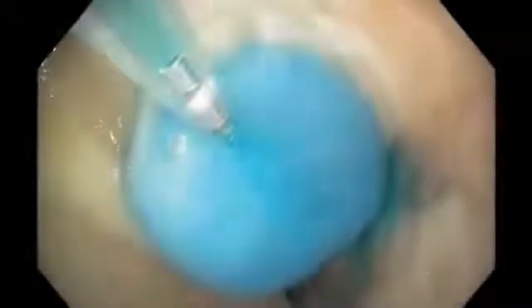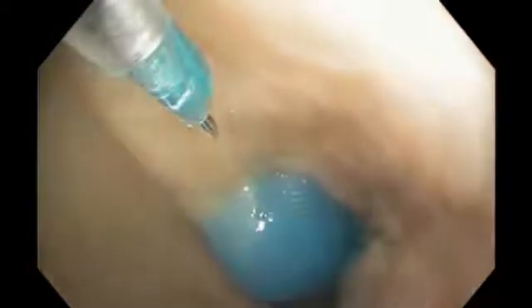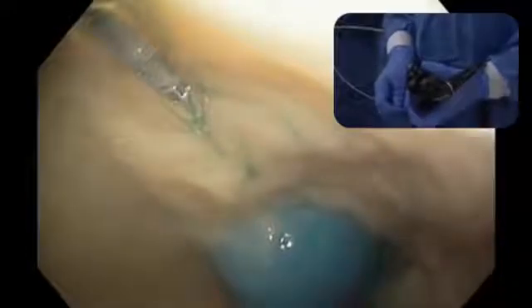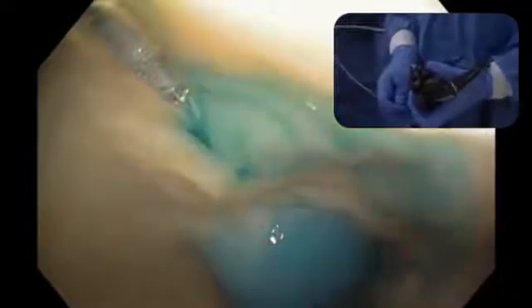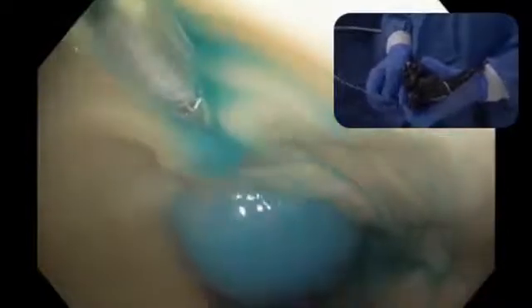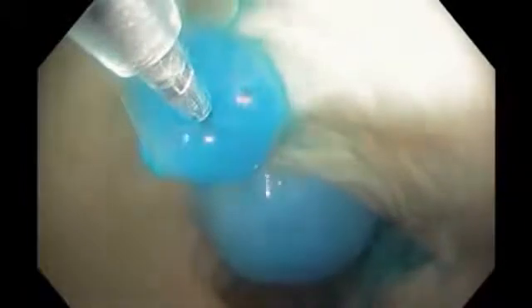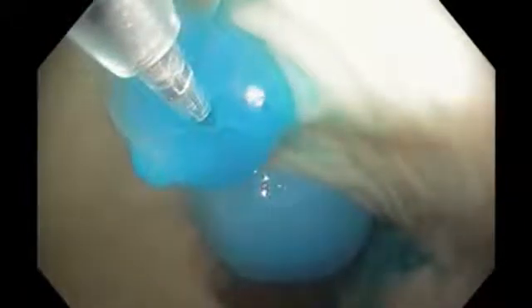The keys, again, to this are to lay the needle on the site. Go ahead and put the needle out if you would. To lay the needle on the mucosa, and then before we insert the needle, start the fluid in. And then as we sort of pop in to the submucosa, that fluid coming out the tip of the needle will actually find that submucosal space for us.